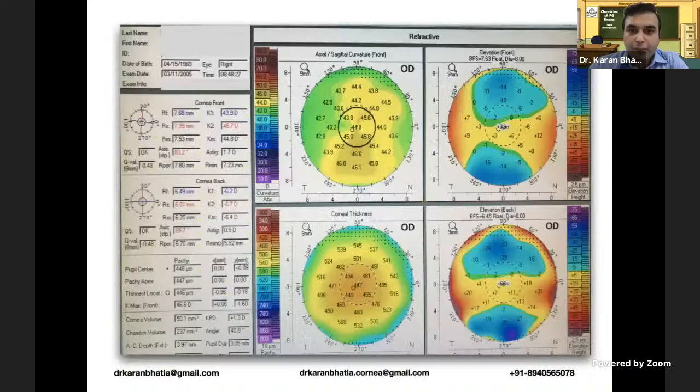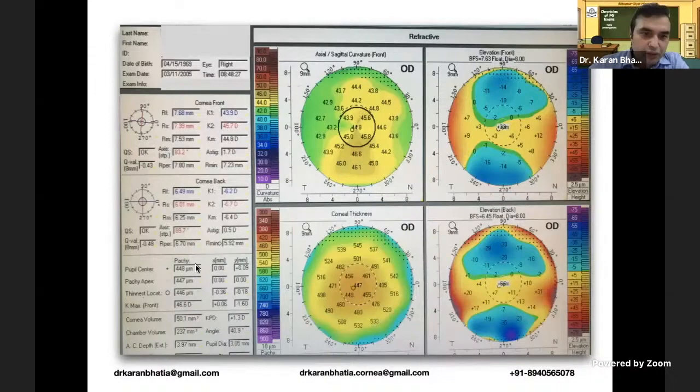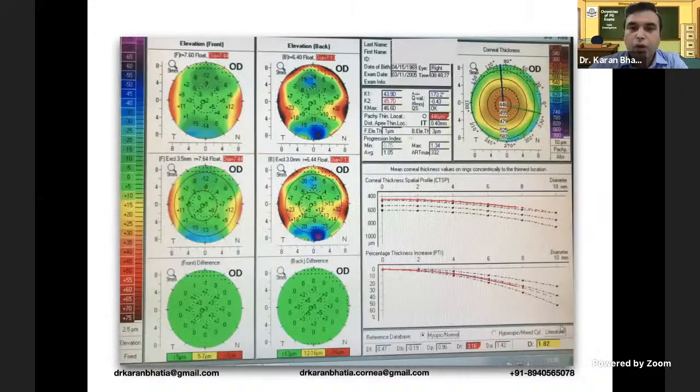In this next case, there is an irregular shape on the curvature map. There is no significant anterior or posterior elevation, there is thinning, but all other values are fine. The Belin-Ambrosio enhanced ectasia display is also fine. So apart from the thin cornea, nothing is abnormal — this would be a case of thin corneas.